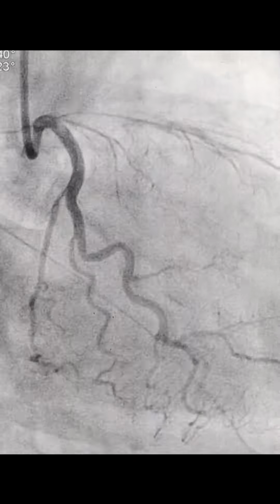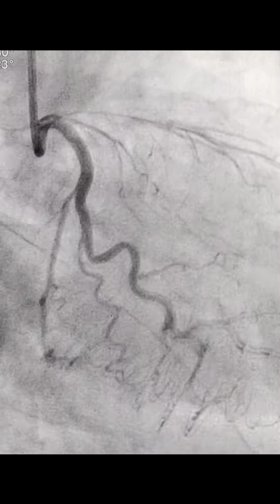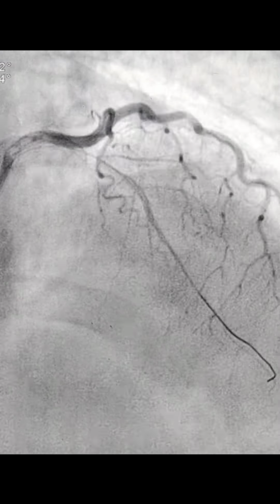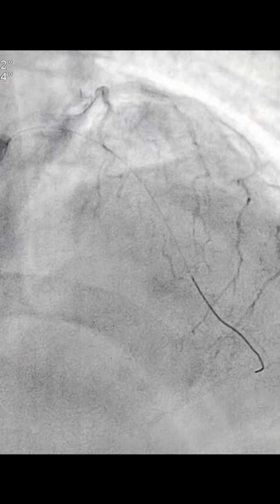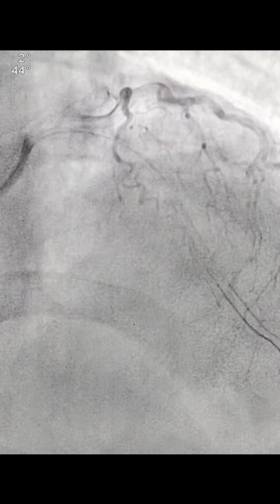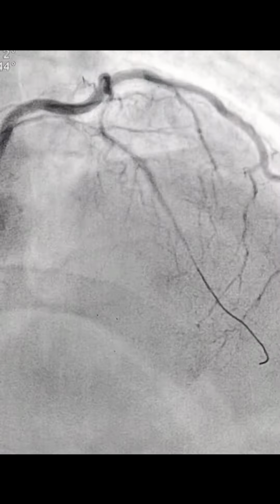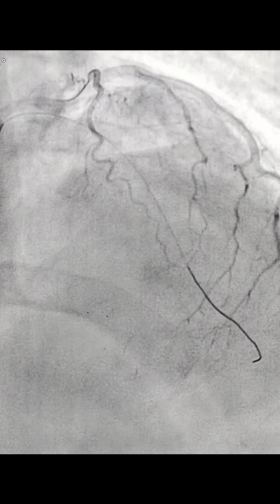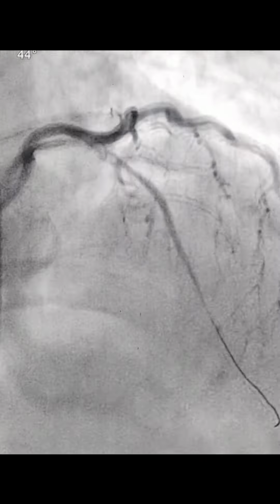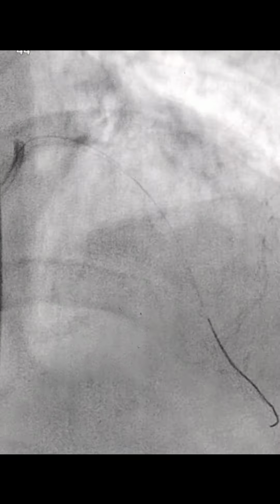And this is the caudal view, and you could see the wire is in the LAD, and the LAD has opened up after giving some tirofiban intracoronary. The cranial view, and you could see the same thing. Wire is in the LAD, which has a separate origin. But this patient is a long-standing diabetic, and you could see the distal LAD is very thinned out. The same thing you can see here. Thrombus is there in the LAD everywhere.